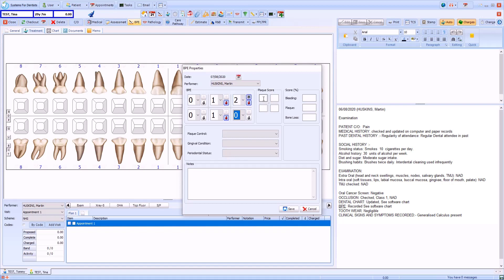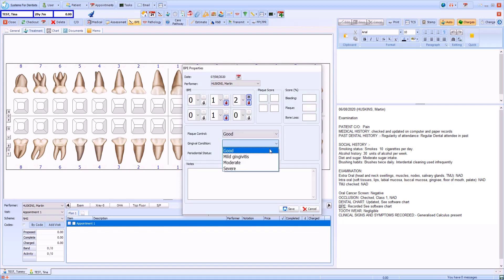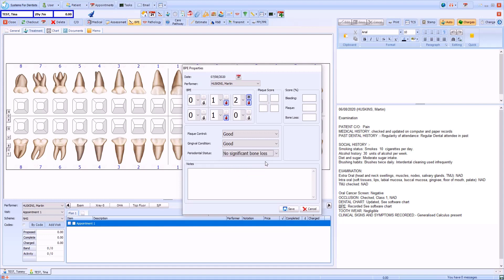Also from the screen you can enter plaque scores, bleeding, plaque and bone loss percentages, as well as information about plaque control, gingival condition, and periodontal status if required.